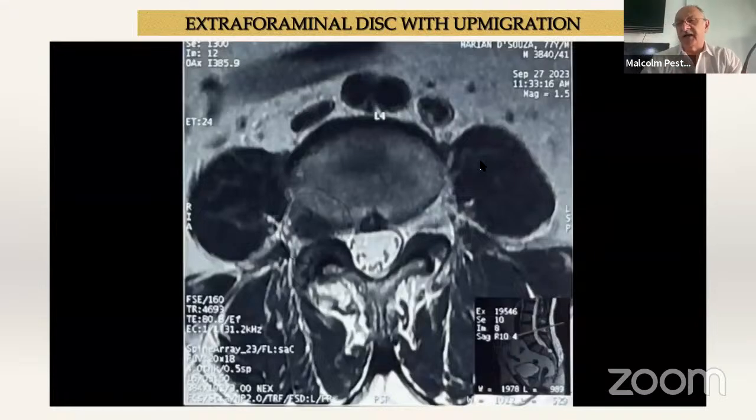What I tried to show you in that video is that when there's a very large down-migrated herniation in the axilla, we are very urged to go in the axilla and pull out the fragment. But at that time, we don't forget that if it's a root at risk, you're crushing that root against the pedicle. So it's better to go for a shoulder extraction of such a thing. And when you remove multiple fragments, you saw in the video how the entire axilla had become free and the root had come close to the main dural surface. You can go underneath the dura, you can walk across the dura, you can go to the opposite medial pedicular line, you can do a lot of work in UB.